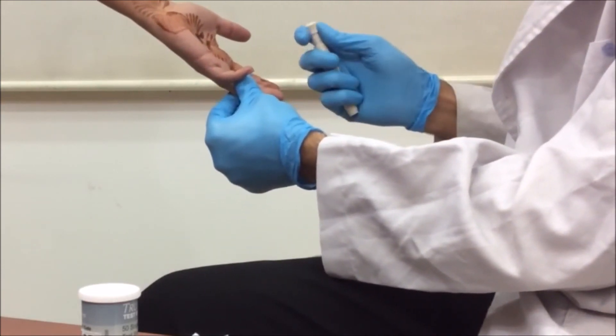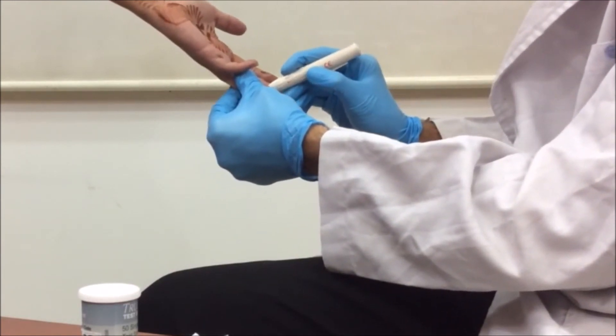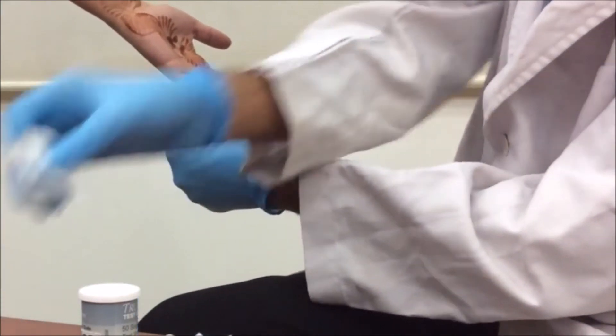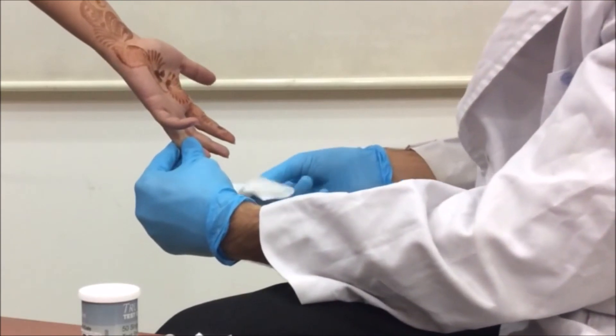Using the button, allow the free flow of blood. Wipe the first drop of blood with the tissue.